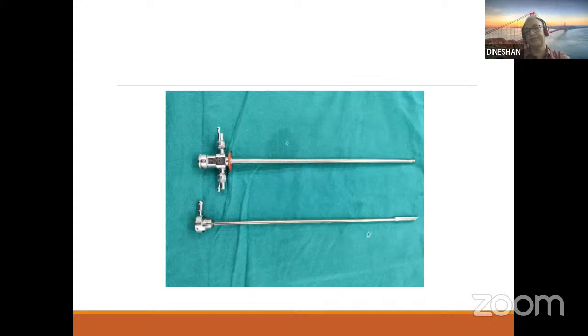So an instrument like an internal urethrotome sheath. We will come to that internal urethrotomy later. Otherwise you will not be able to do a urethroscopy in a female with the 19 and above sheaths.